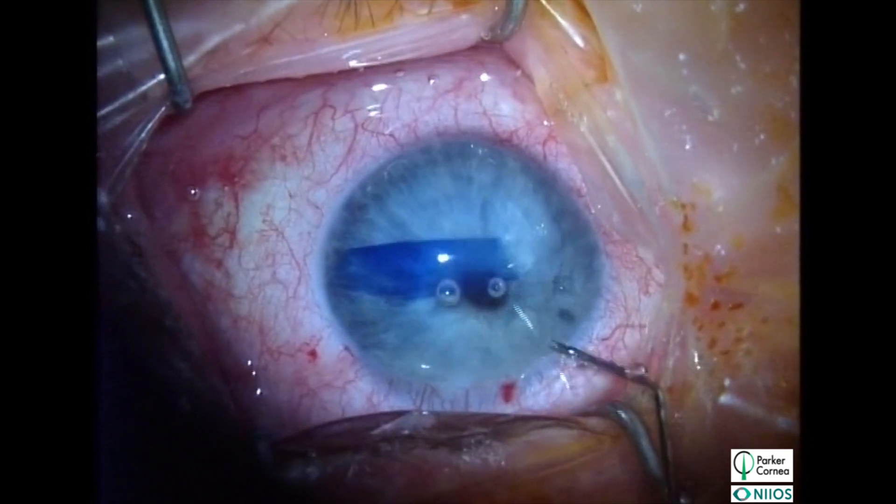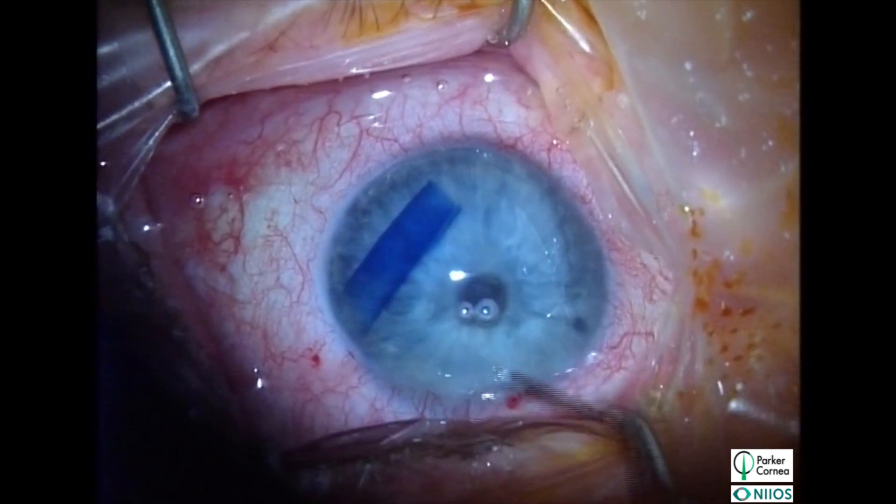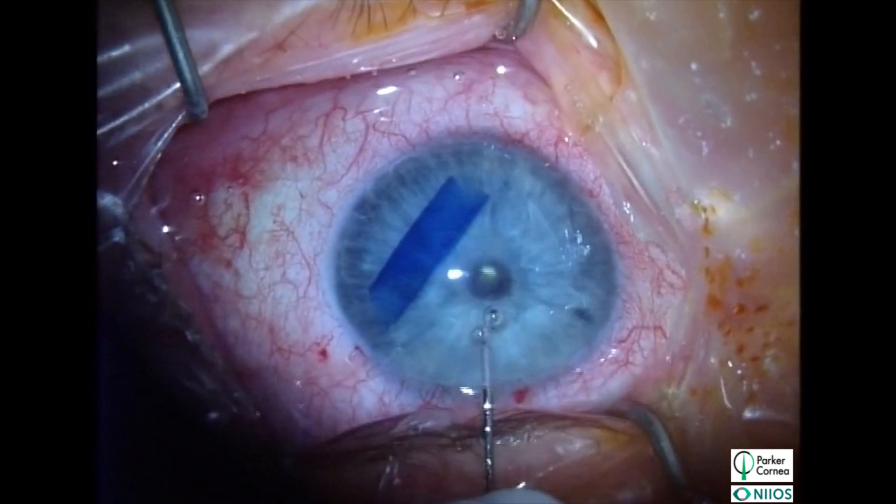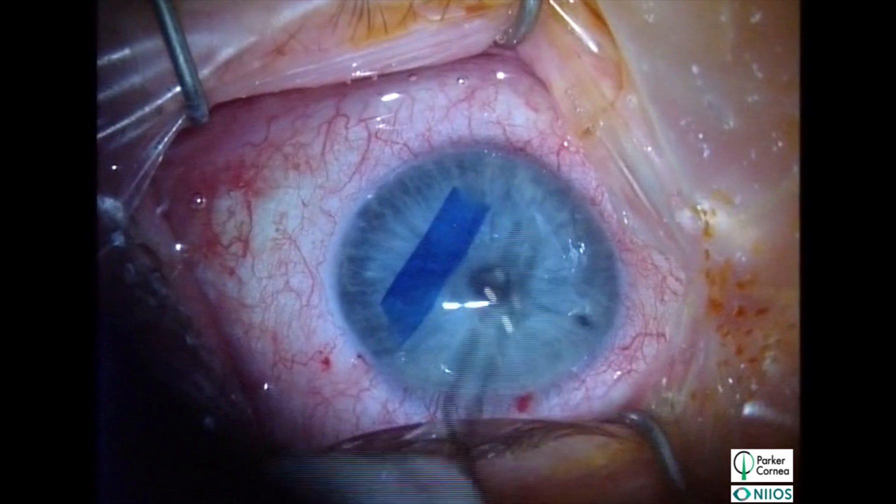The smaller graft responds more rapidly to intracameral bursts of BSS. Also, make sure to remove any bubbles from the anterior chamber as they will interfere with graft manipulation.